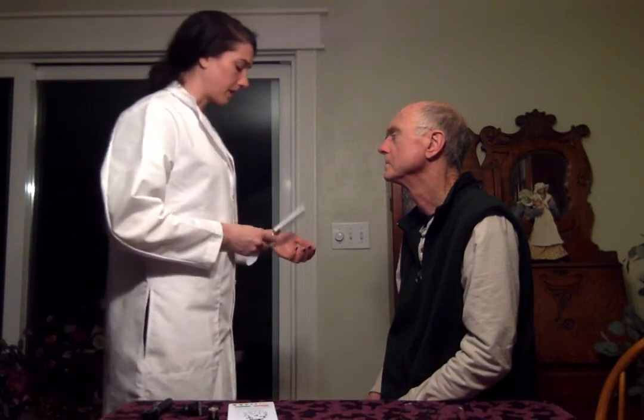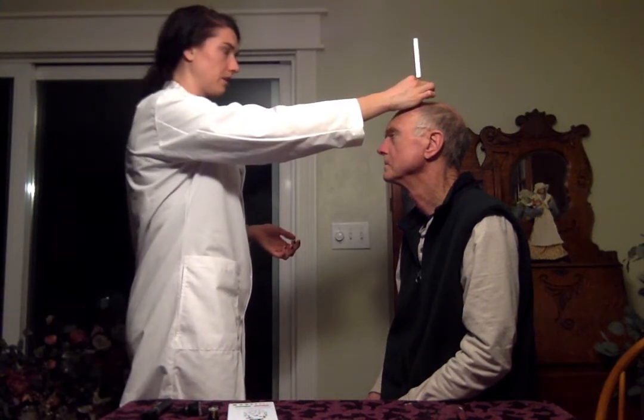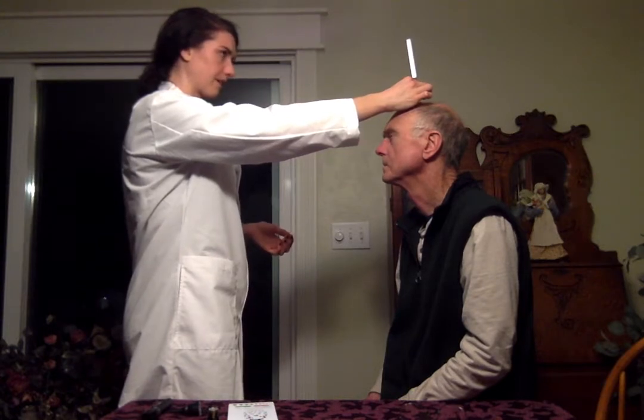I'm also going to do the Weber test. So this tests the conduction between both ears. So he's going to either feel or hear this. And if he only hears it in one ear, that would be an abnormal finding. So I'm going to go ahead and put it on his head. Tell me, can you hear this in both ears? I think so. Alrighty. So you can hear it in both ears, which means conduction is equal on both sides.